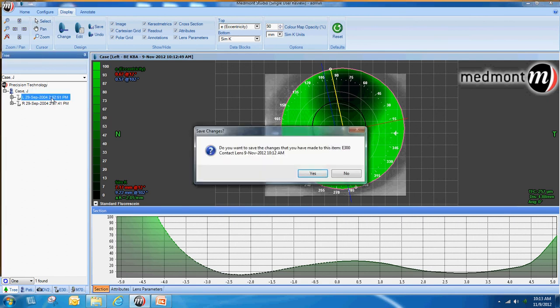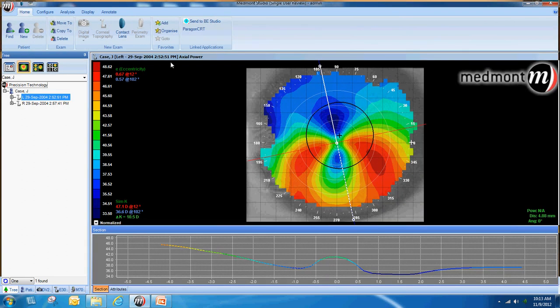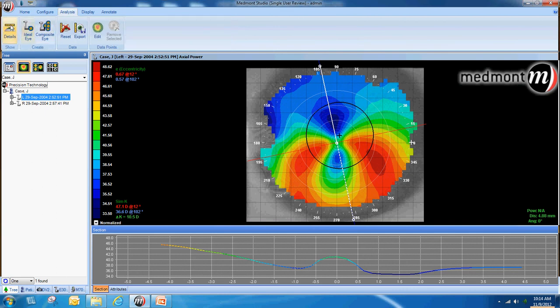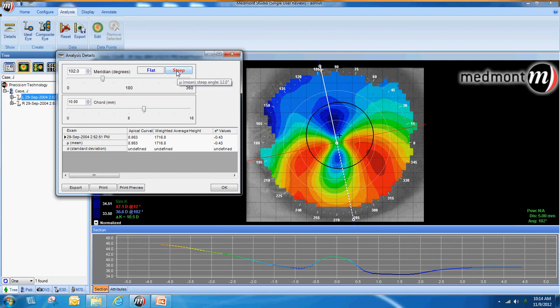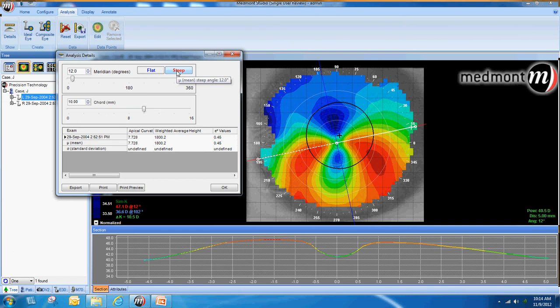Therefore, let's fit this patient with a scleral lens. We select our map, go to Analysis and Details, and set our cord diameter at 10 millimeters to measure across the eye. We click on the flat button and observe the weighted average height — the sagittal depth of the eye. Across the flat meridian, the vertical meridian, the eye measures 1,716 microns. We might then click on the steep meridian to determine the highest axis of depth on this eye.